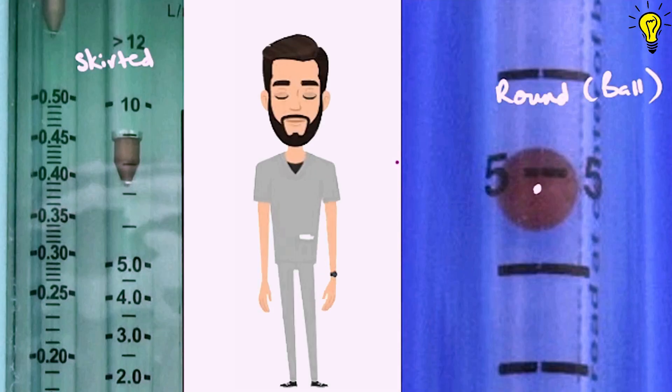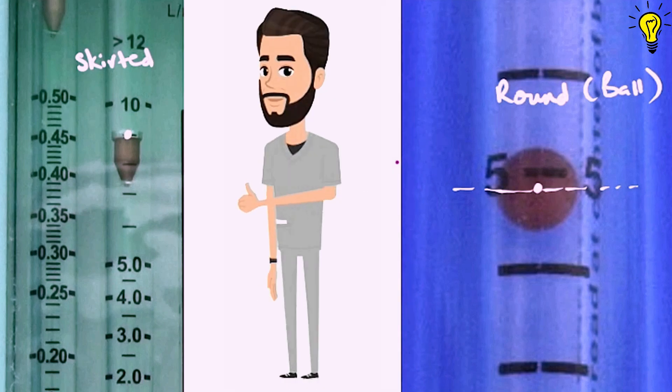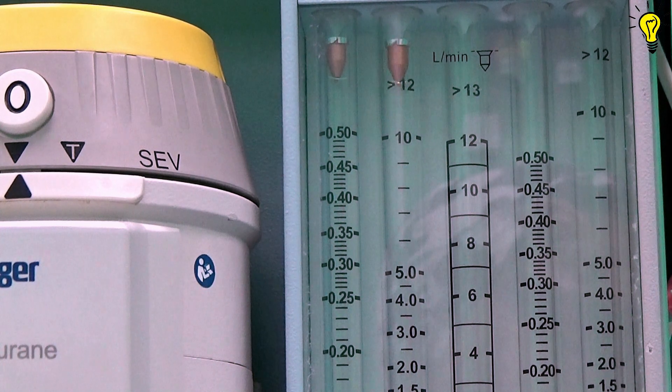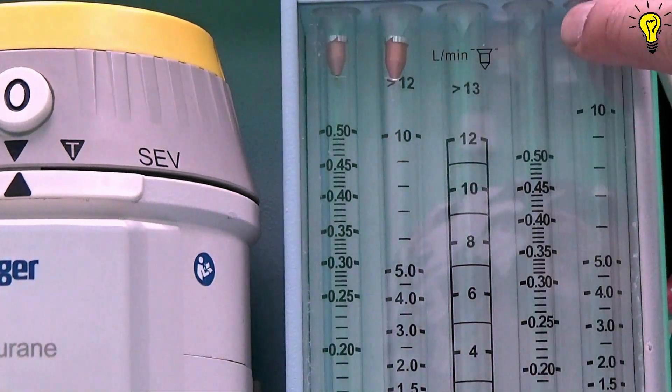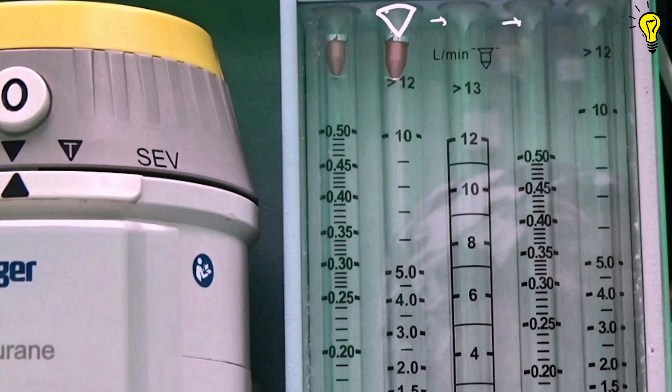For the ball type, you measure the flow taking the center of the ball as landmark. For the skirted type, the upper part of the float is taken as a reference point. On top of the top tubes, you can see these small stoppers. They prevent the float from blocking the outlets for gas.